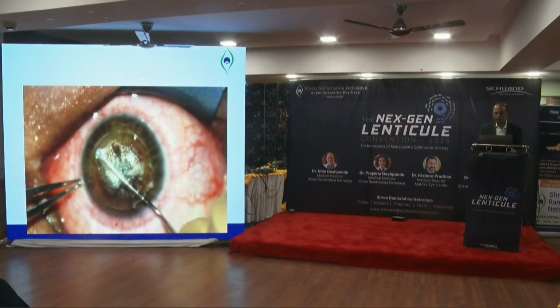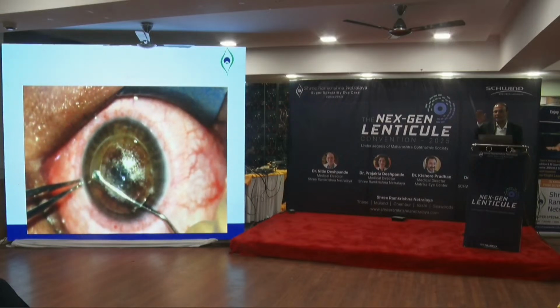And how do you know whether you're in posterior? You will feel a little resistance again. Like if you have done anterior and then gone posterior, and you don't get any resistance, you know you are in the wrong plane. So you know that you have dissected posterior first. So you should feel that resistance. So this surgery is different from LASIK. It's all about the feel. And feeling that resistance is very important.